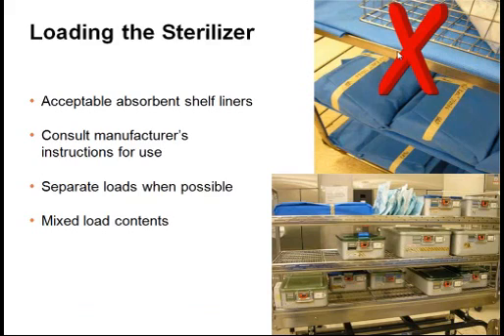Containers must be placed flat on the sterilizer cart shelves. It is acceptable to place rigid containers over other rigid containers. Challenge packs should be placed flat on the bottom shelf over the drains. Do not allow items to touch the chamber walls or they could contact condensation. Use sterilizer carts whenever possible, allowing items to remain on the carts until they are cool to touch.